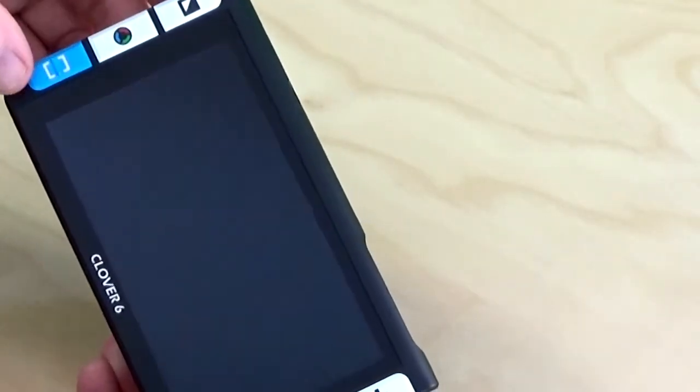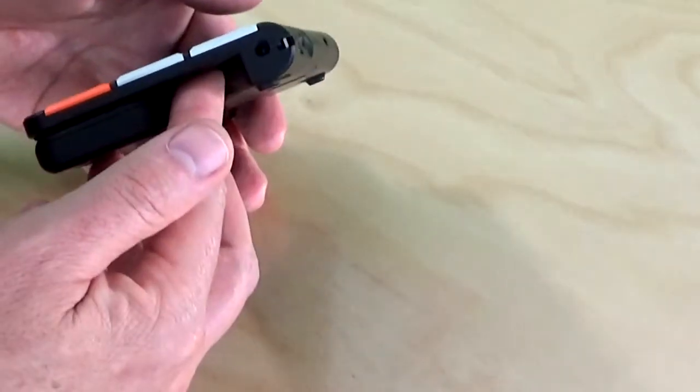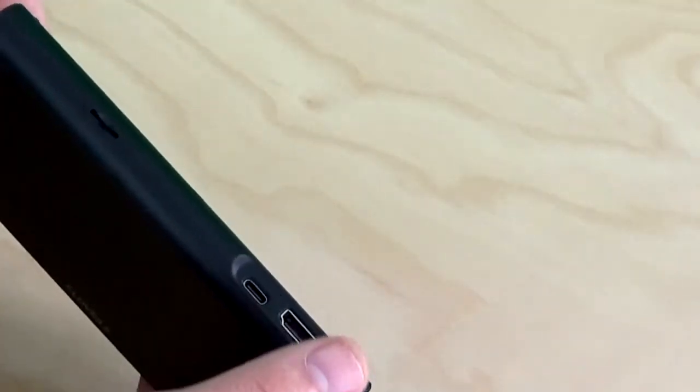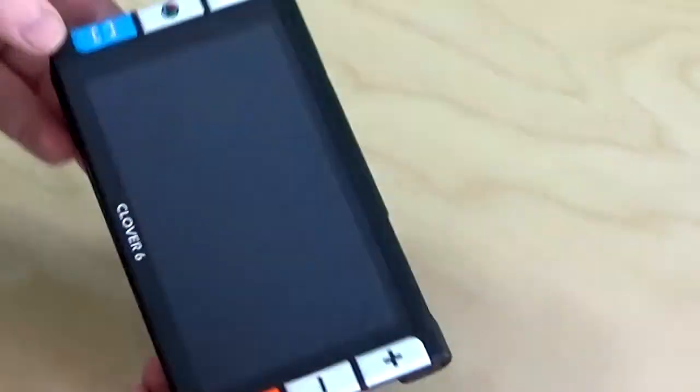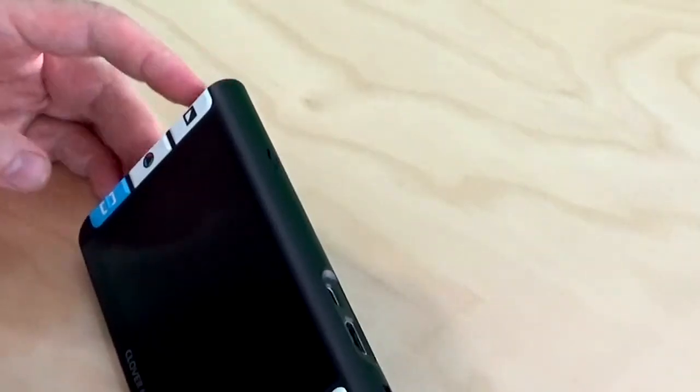You have buttons along the sides. You also can control with the touch screen — multiple ways to control. It connects to a larger monitor, which makes it really easy to use the Clover 6.